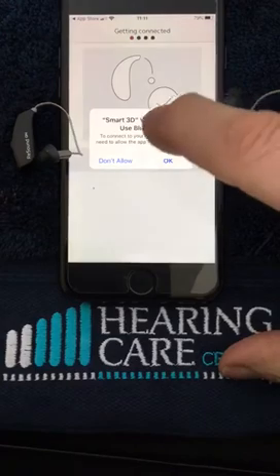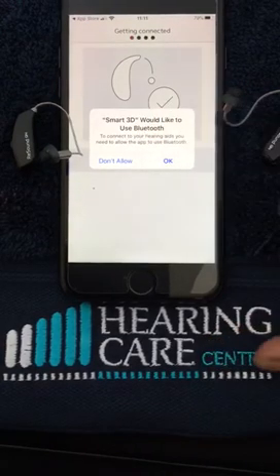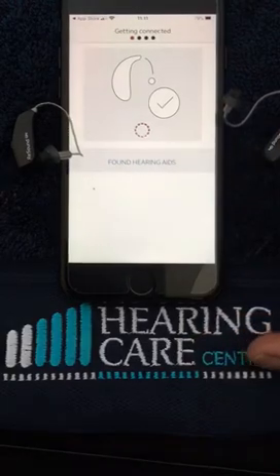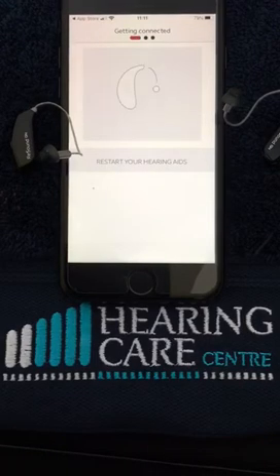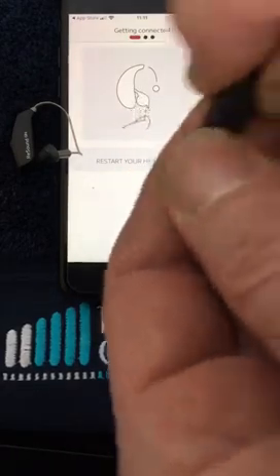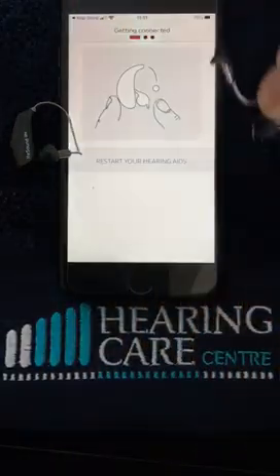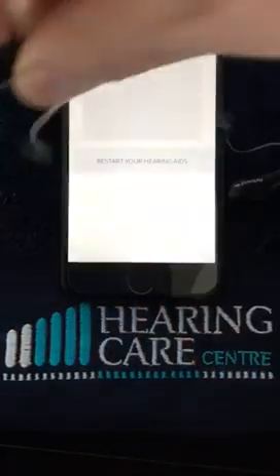It's asking us to connect to Bluetooth, which we've already got switched on, so we hit OK. It's now finding the hearing aids, as you can see. It then asks us to restart them, so we do the same process of opening the battery doors and closing them, or indeed putting them in the charger and taking them out again.